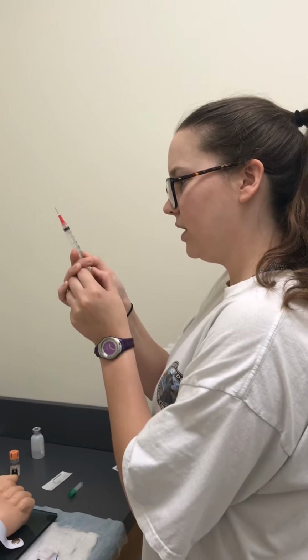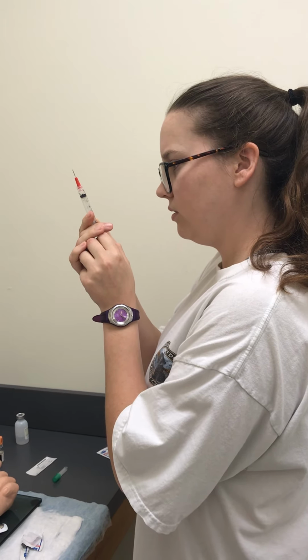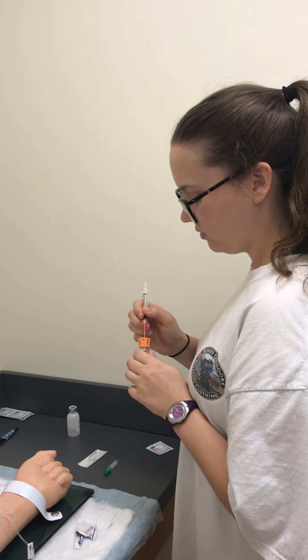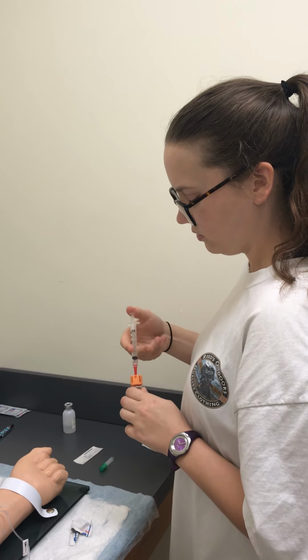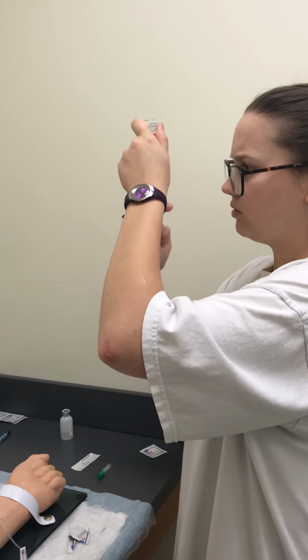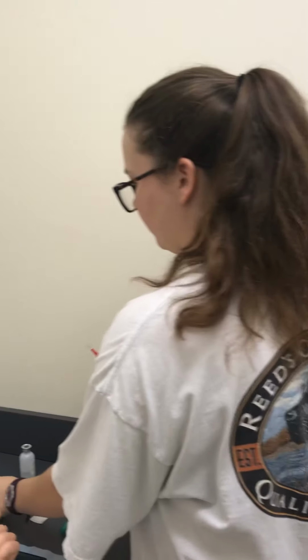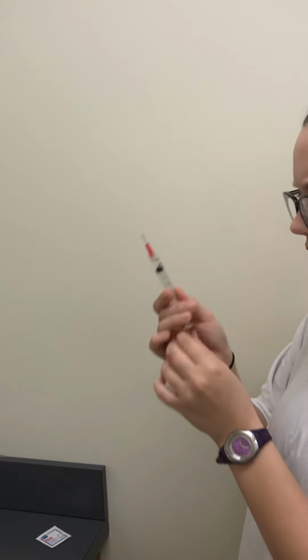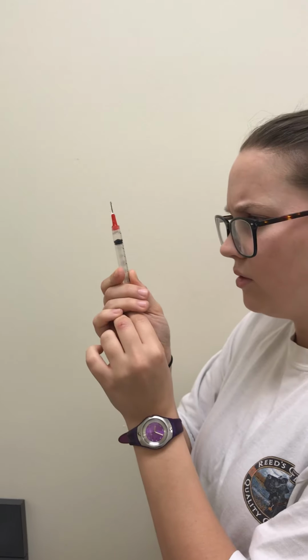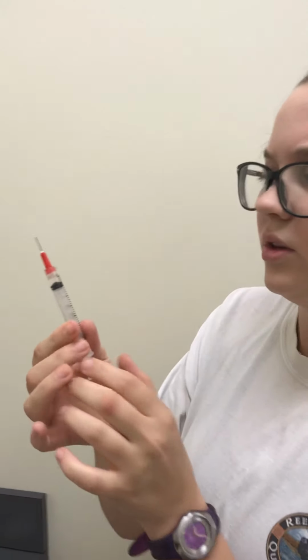I'm going to pull back to 0.3. Okay, that's 0.3 of my Solumedrol.